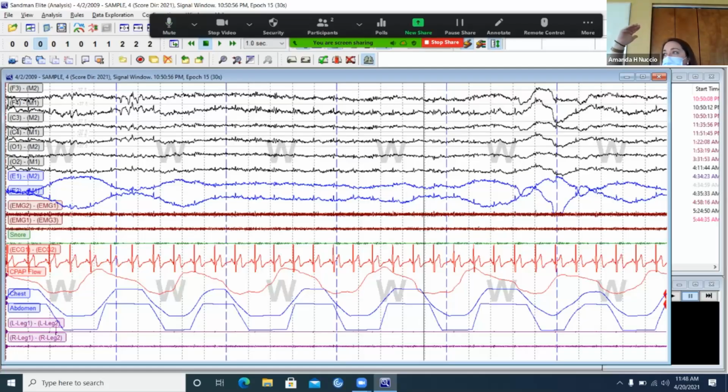So we create this window where everything within these filter settings would be normal. Anything outside would be abnormal, and typically artifact or not physiologic for brain waves. Does that make sense? This is a better review now that you have a better handle on the basic principles. Okay. So filter settings.